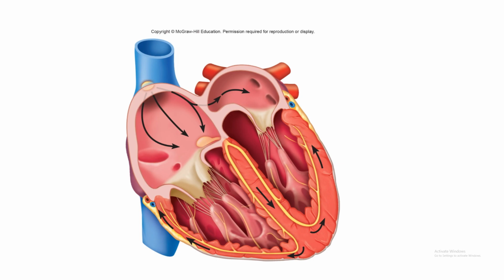And that pause is what it's going to look like on your EKG. I know I keep referencing an EKG strip, but this is what we're going to be talking about as far as cardiac dysrhythmias, so I might as well make it make sense at this point, so you know what you're looking at. So anyways, this impulse is going to get to this AV node here, and there's going to be a little bit of a pause, and that's going to be your PR segment.